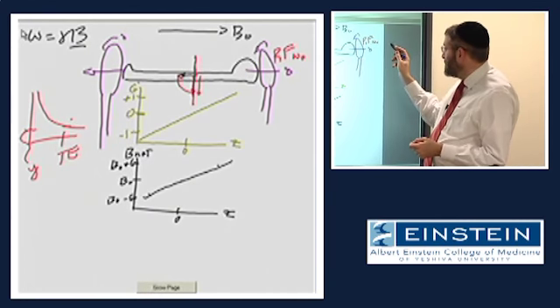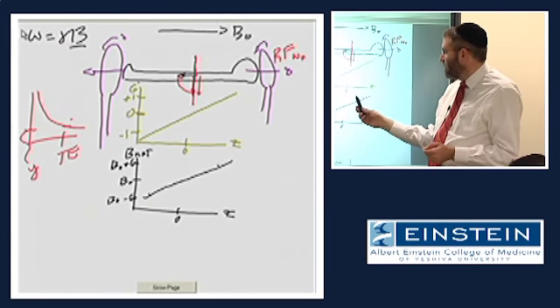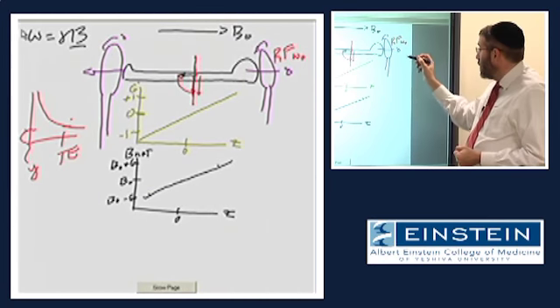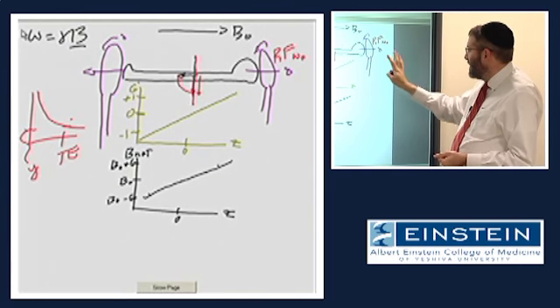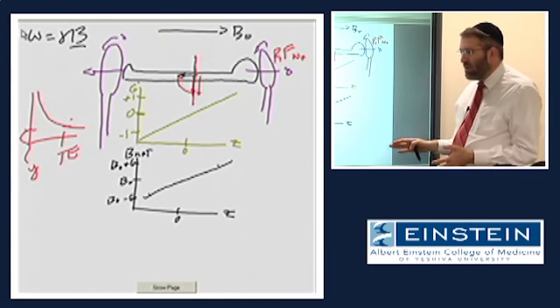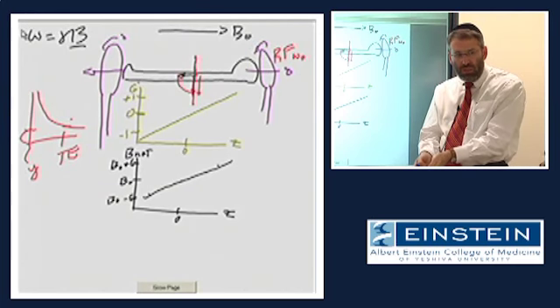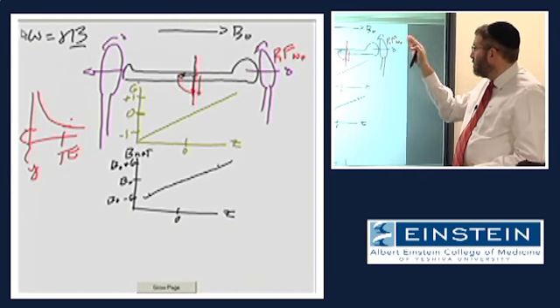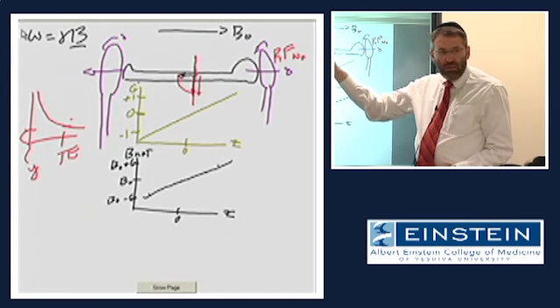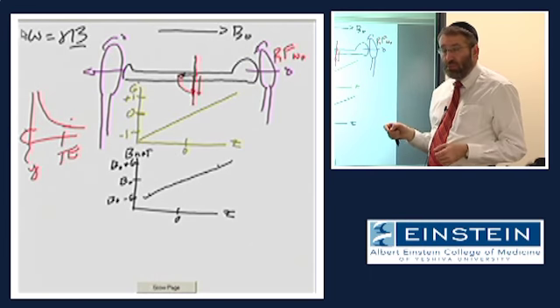So in choosing the correct frequency, in the presence of this gradient magnetic field, we can essentially select a slice. Now notice that when we turn on this RF, it's equally applied to the entire body. It's not, unlike CT, where you collimate the beam into a thin slice that goes through the patient. In MR, when we apply this RF, which is going to generate our signal, it's equally applied to the entire volume of tissue inside the scanner, or at least inside the coil that's applying that RF.